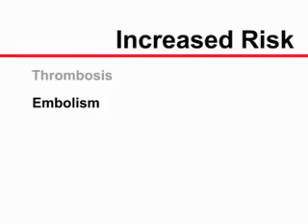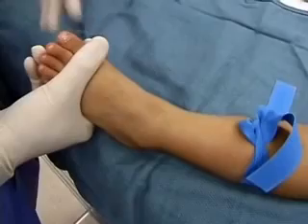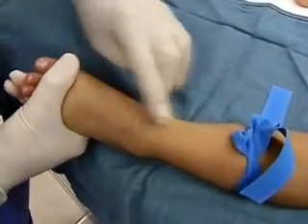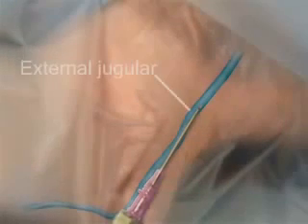with upper extremity veins. This risk is lower in children and infants. Therefore, the veins of the legs and feet are an acceptable alternative when cannulation of the upper extremities has failed. Other alternative intravenous cannulation sites include scalp veins, used in neonates and young infants, and the external jugular vein.